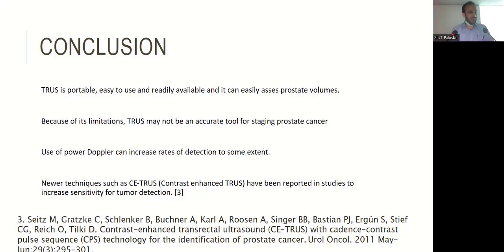You can also use it for detection of carcinoma, where the ratio between the vessels and the parenchyma is altered slightly differently. You can also guide your needle, for instance at the 5 o'clock and 7 o'clock positions, where the neurovascular bundle enters and exits the prostate, by having this mode turned on.